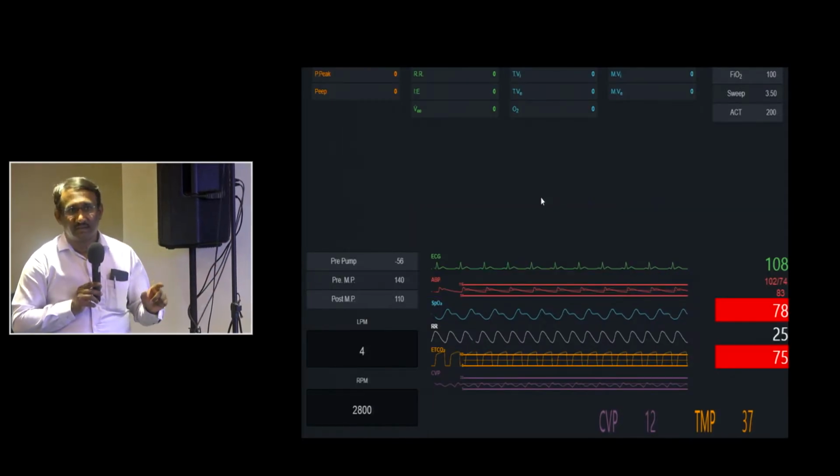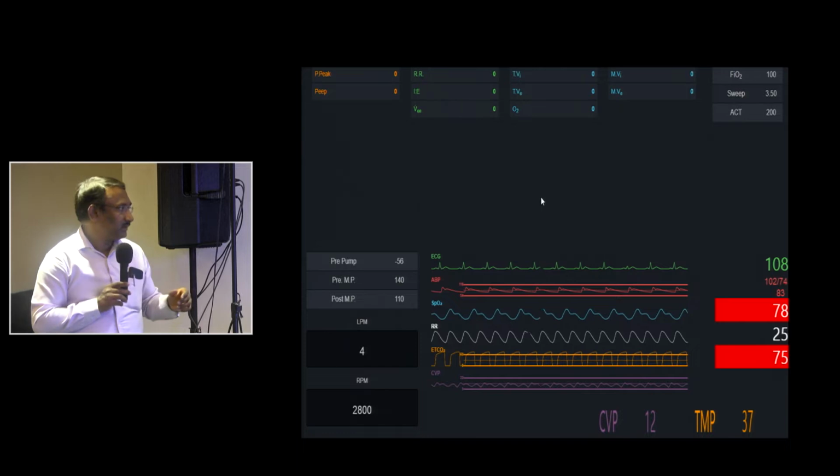How are you going to see the cannula size? See the vessel size, into 3 is the maximum you can do. You discuss with your perfusionist, whatever is required. If it is smaller than that, you can do. So a little bigger also, probably you can dilate and do it. Okay, next we'll go.